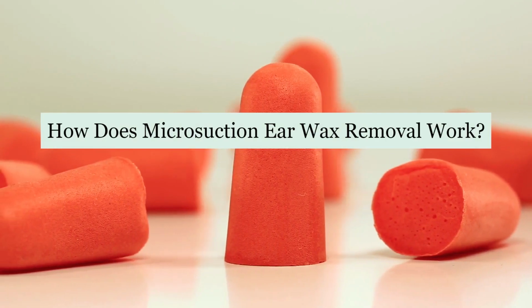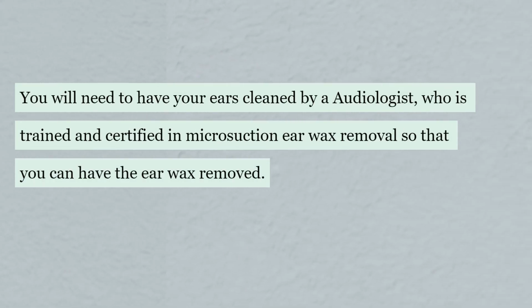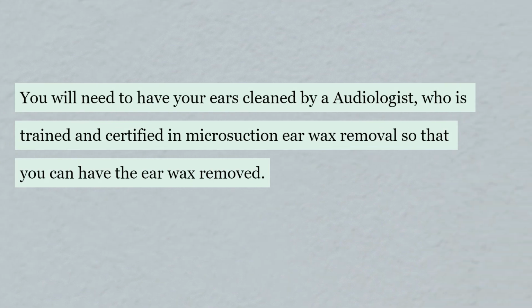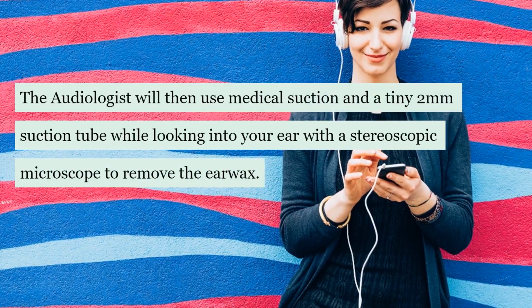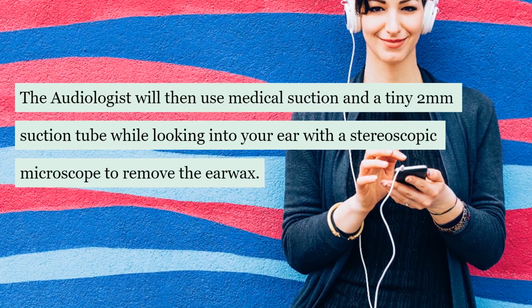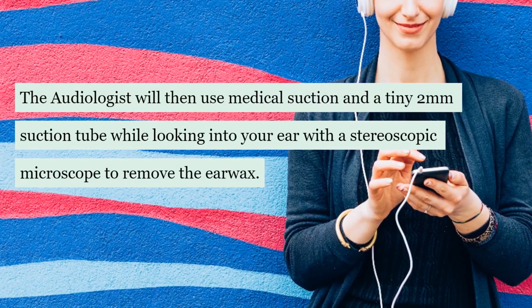How does microsuction earwax removal work? You will need to have your ears cleaned by an audiologist, who is trained and certified in microsuction earwax removal so that you can have the earwax removed. The audiologist will then use medical suction and a tiny 2 mm suction tube while looking into your ear with a stereoscopic microscope to remove the earwax.